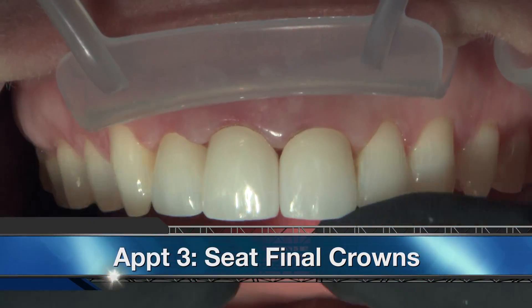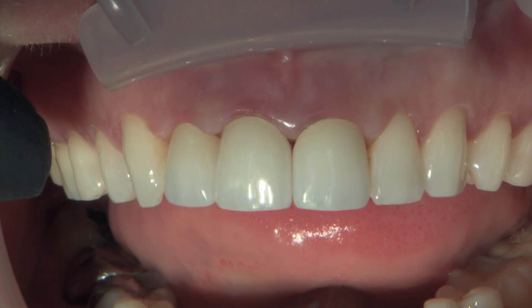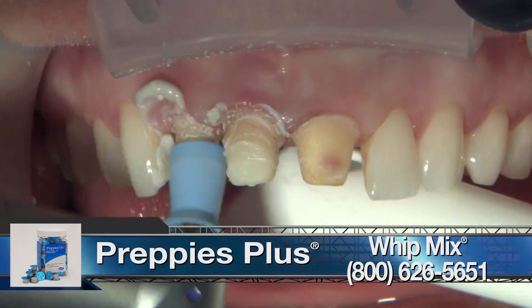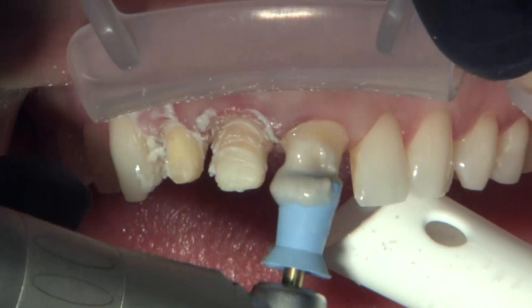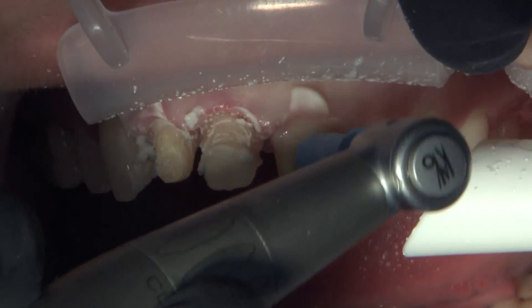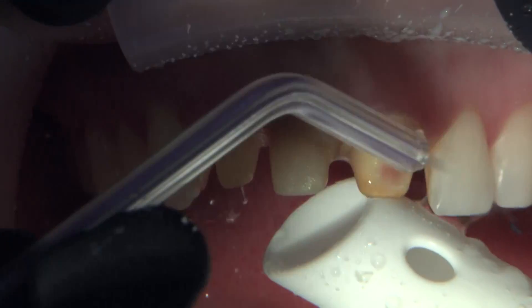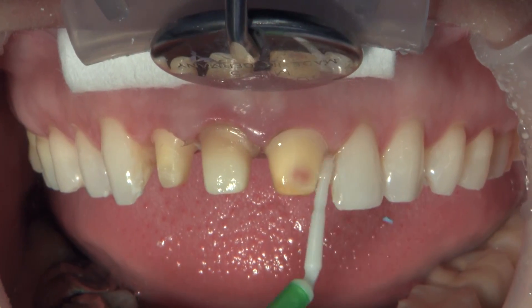The patient's back and it's time to try in the crowns. You can see we've got some black triangles, and I'm going to have my technician Cindy add a little more material possibly. These are going to be monolithic Bruxer anterior restorations. The amount of closure you get on a black triangle is determined by how far subgingival you go with your restorative margin — the farther subgingival, the more room you give the technician to close it, but you also run the risk of creating a biologic width violation. We can see that pulp showing pretty clearly through the dentin on tooth nine.